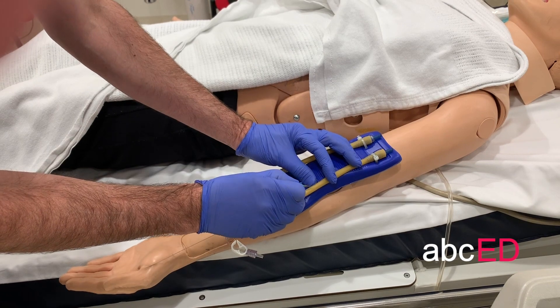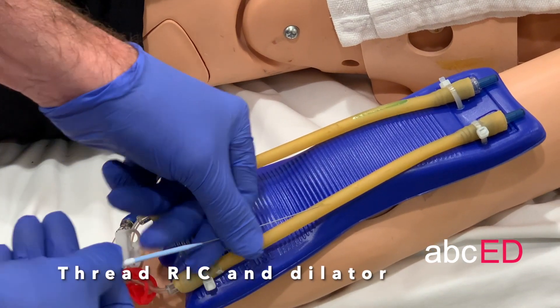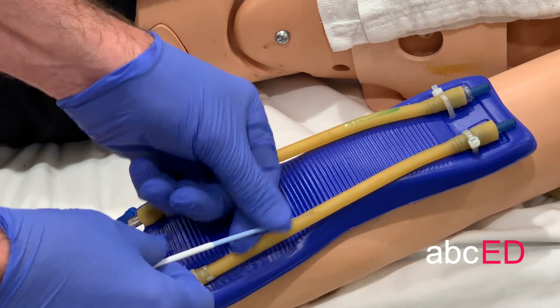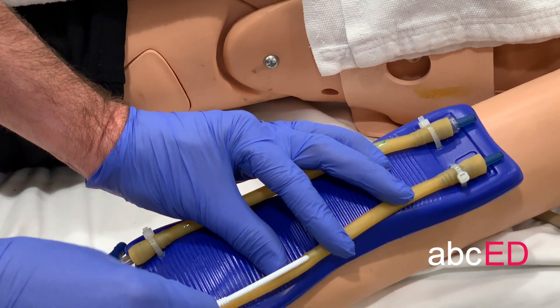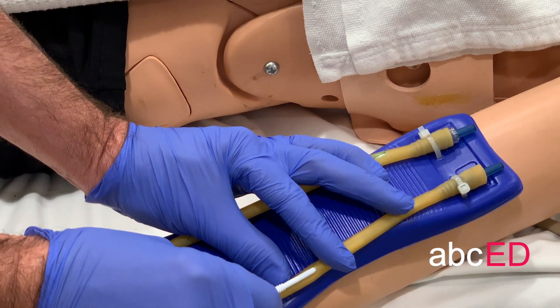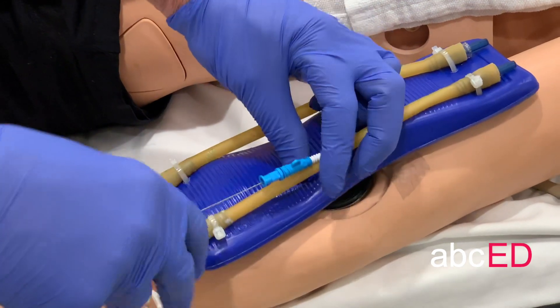Make a small cut down onto the wire so the wire comes out there, then insert and pull.